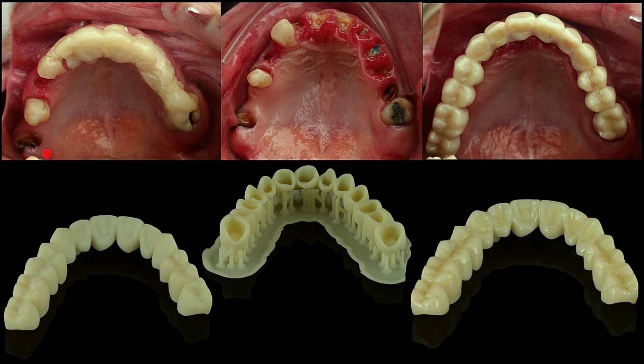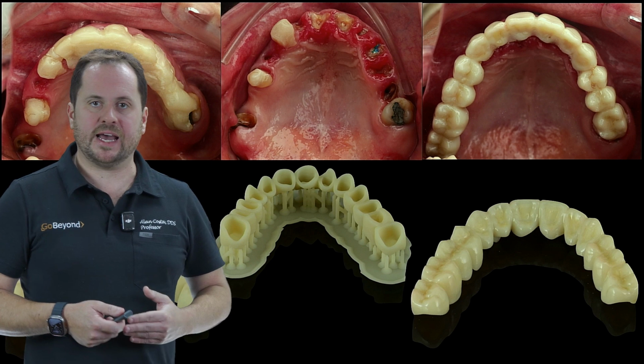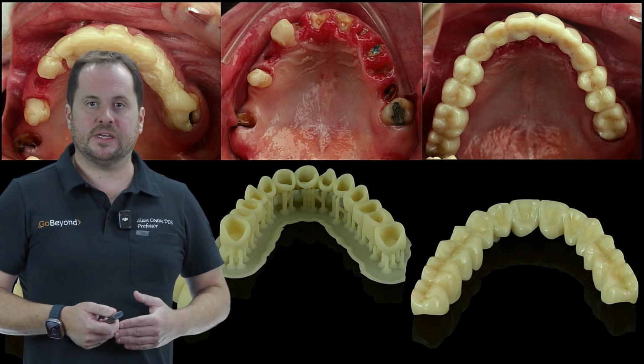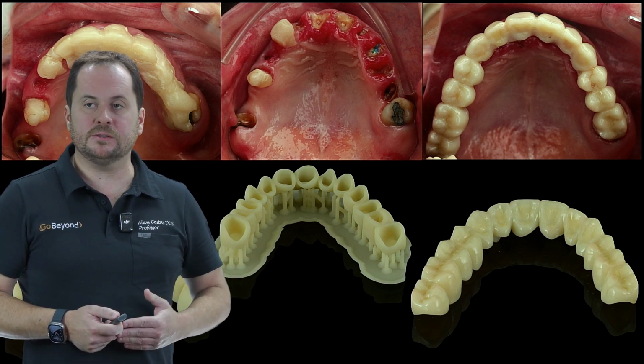So the patient did the scanning with us. In this region, the prosthetist made the provisionals, more or less following this type of provisional adaptation, shape, and distribution of the teeth, so that we could have a provisional to do a rebase, like the one you are seeing here, a printed provisional right at the time of removal of those old temporary prostheses that the patient had in that old fixed bridge, which was made a long time ago and was being patched up.